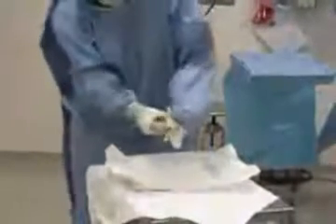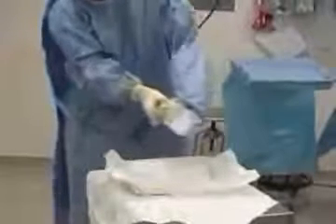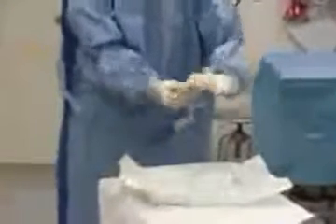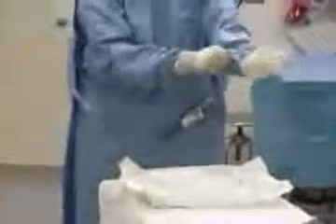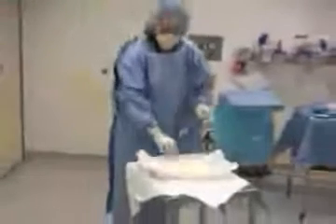Thumb to thumb. The thumb of the glove is here and my thumb is here. I have the cuff — I've grasped the cuff with the blue part of my gown, the opposite side with my glove hand this time. Again, I open it up and as I open up the glove, I put my hand through. And now I have my sterile gloves on.